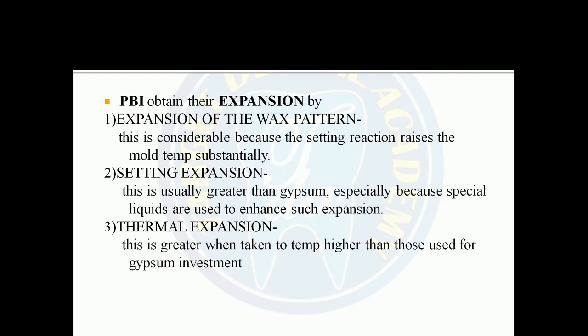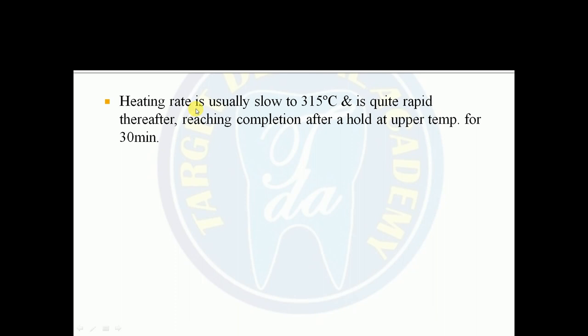Important points. Heating rate is usually slow up to 315 degrees Celsius and then rapid. Why? Because thereafter, the reaction reaches completion after a hold at the upper temperature for 30 minutes.